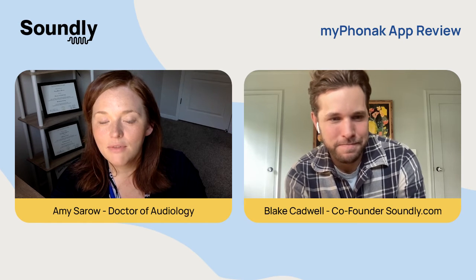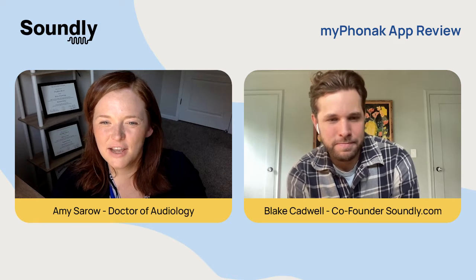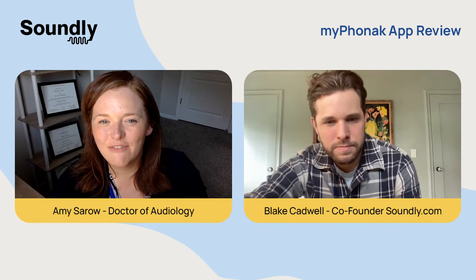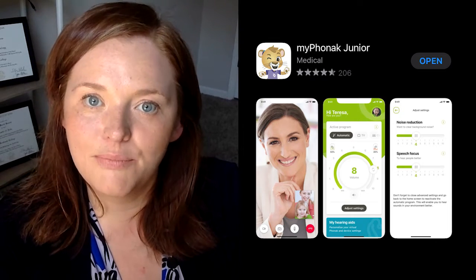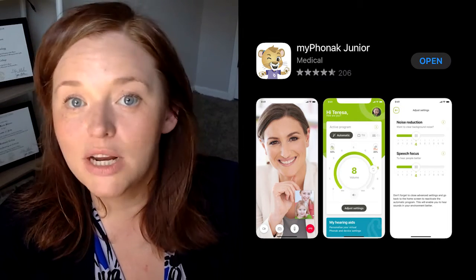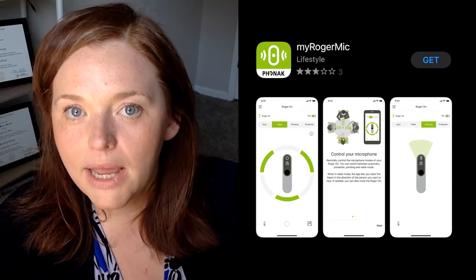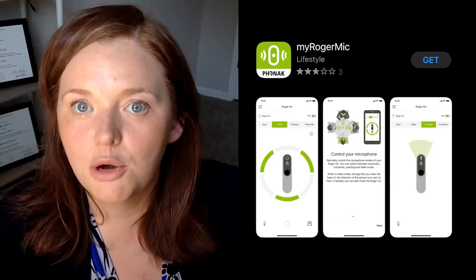Absolutely. You have the main one, the My Phonak app, which you'll use for your hearing aids for most adults. And then for pediatrics, we have the My Phonak Junior, where they have some controls that they can access with parental control features. And then there's another app, the My Roger Mic, where you have some additional controls if you do have a Roger product.